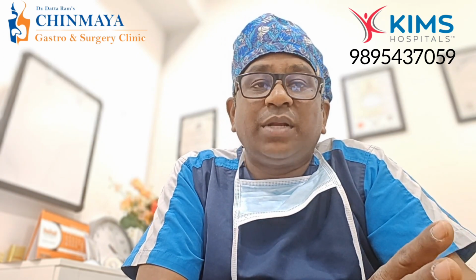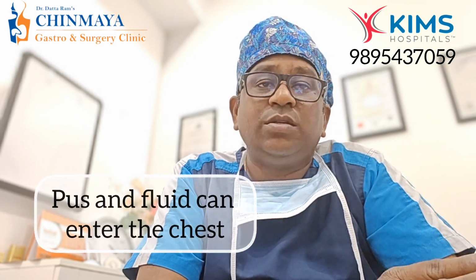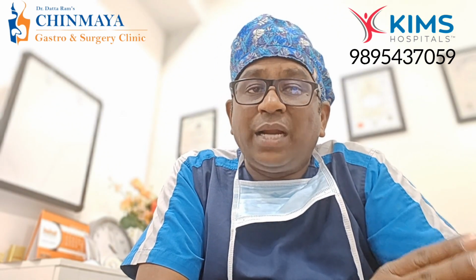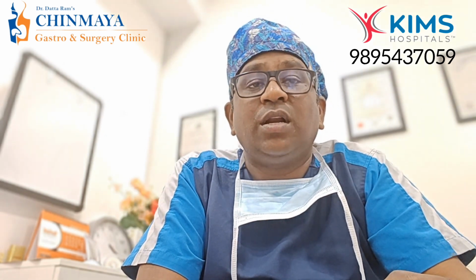And the second thing is sometimes the fluid can enter the chest, that is another complication. This complication is very uncommon or very rare because we are doing the procedure under ultrasound guidance. This is not a blind procedure, it is done under ultrasound guidance, and it is very safe to do the procedure under ultrasound guidance.